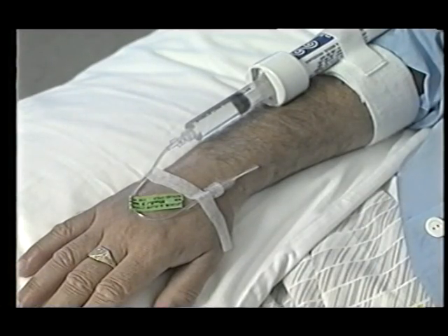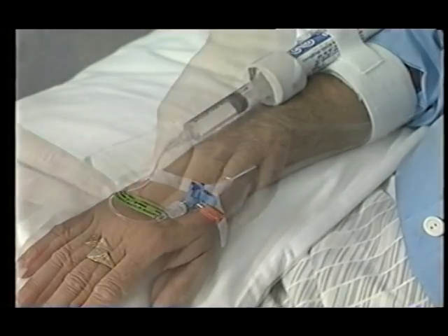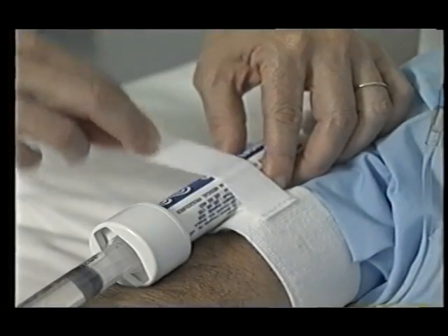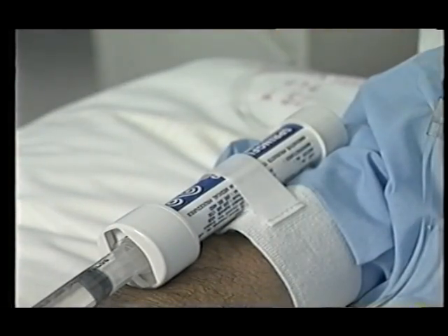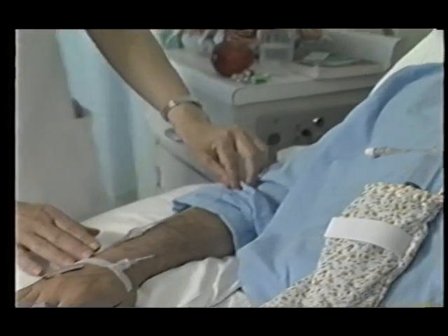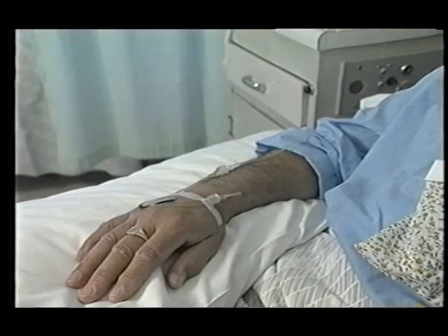The flow control tubing can be connected directly to the cannula. However, if the patient requires other injections or fluids, a three-way tap or V-set can be connected between the tubing and the cannula to allow additional venous access. For short term infusion, the device can be simply strapped to the forearm. For longer term infusions, it's preferable to hang the Spring Fuser around the neck, in which case a low volume extension set is added between the syringe and flow control tubing.